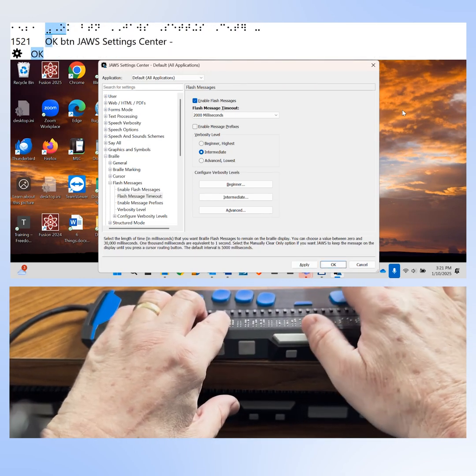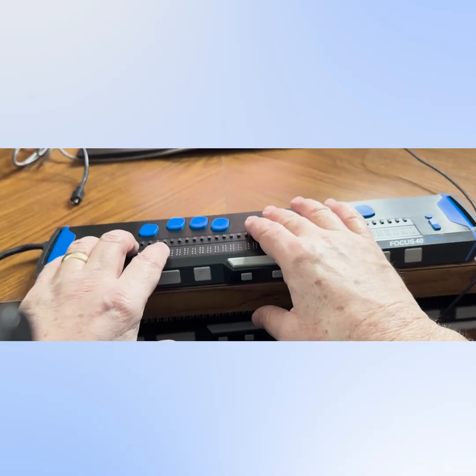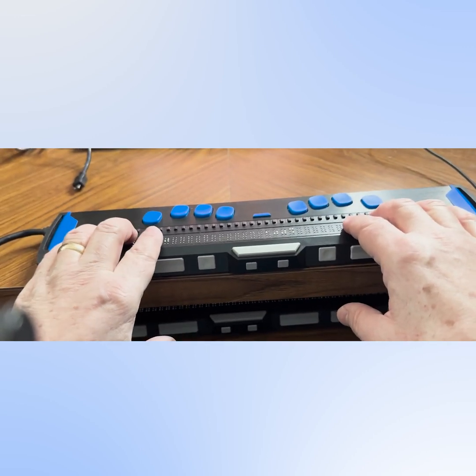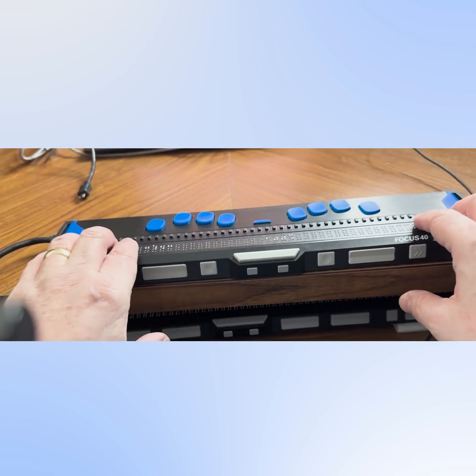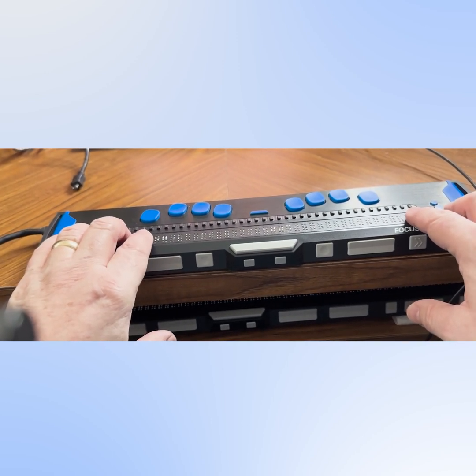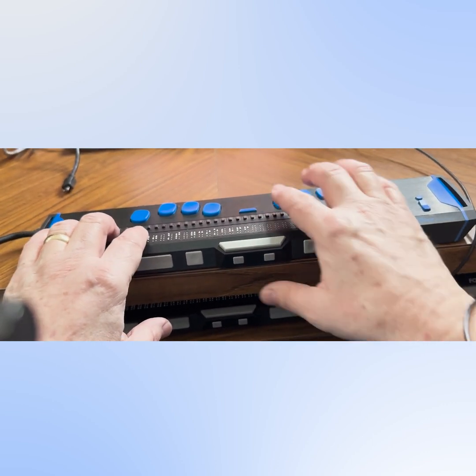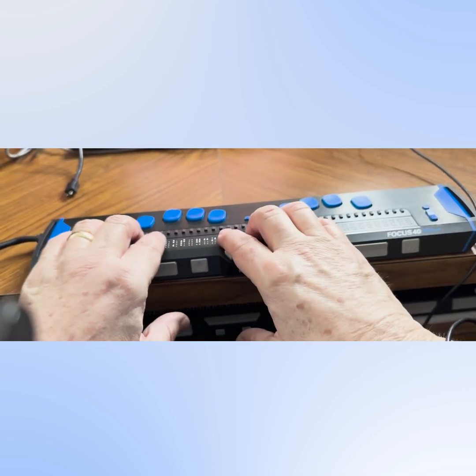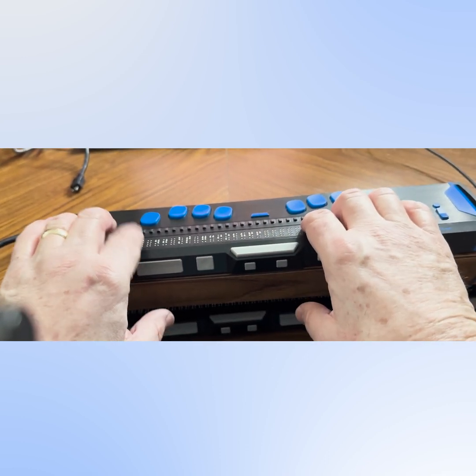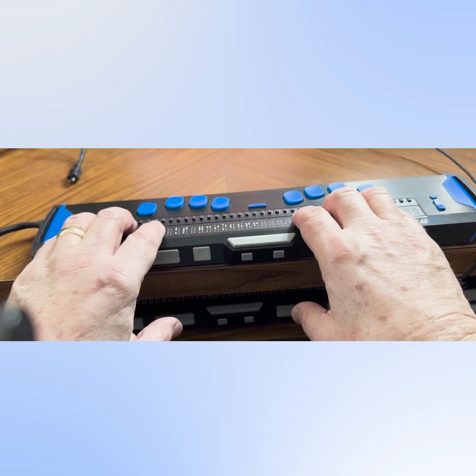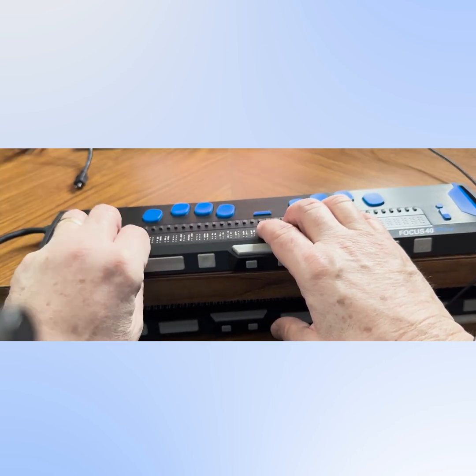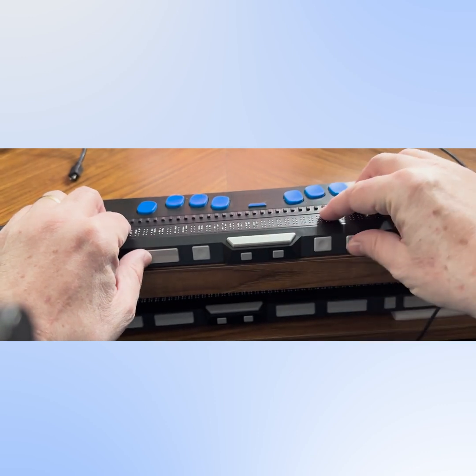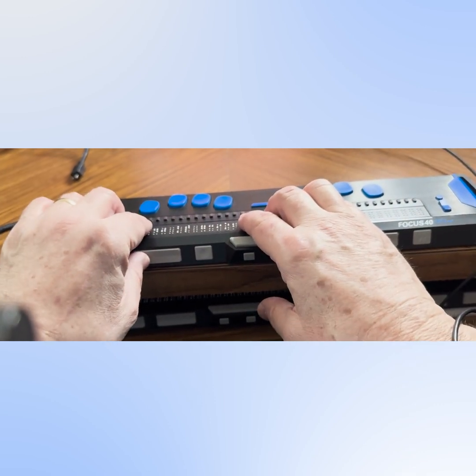Setting the clock on the Focus Blue Braille Display involves using the Clock Settings option in the configuration menu. To open the configuration menu from the status line — which is displayed when there are no active connections — you press the Menu button. The Menu button is the button which appears between dots one and four on the braille keyboard. Once pressed, the configuration menu opens and you'll see Focus 14, 40, or 80 depending on your Focus Braille Display version, and the Bluetooth MAC address. Navigate through the configuration menu by pressing the rocker bar up or down on the front of the braille display.